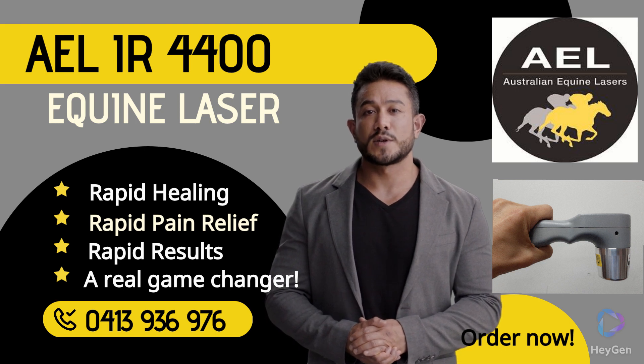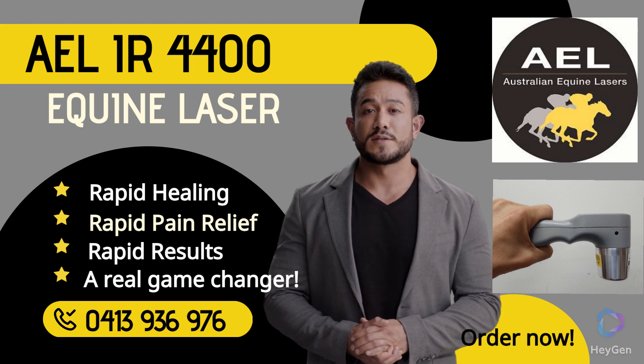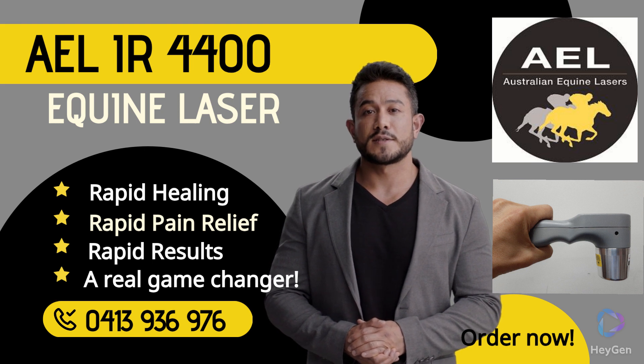The 4400 is used to treat arthritis, back pain, injured muscles, tendons, ligaments, pasterns, fetlocks, stifles, hooves, as well as many more conditions.